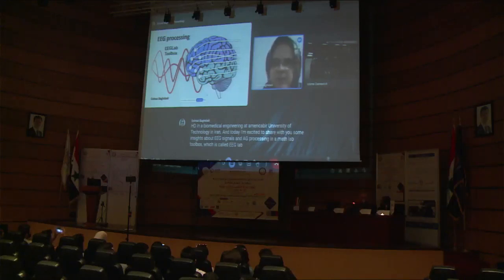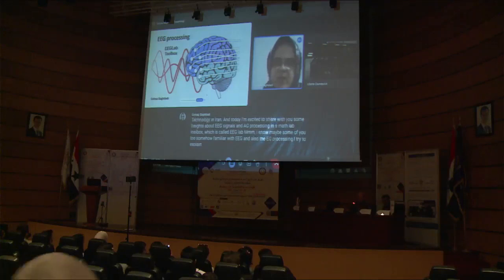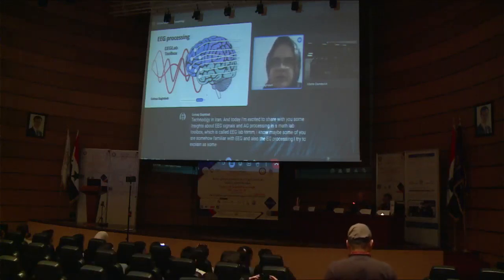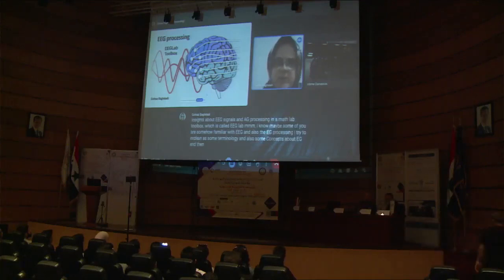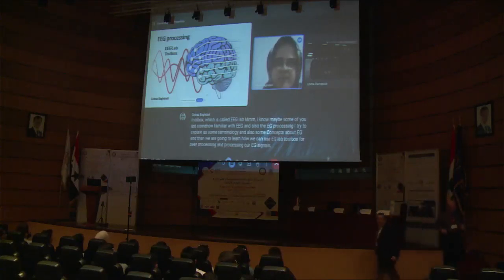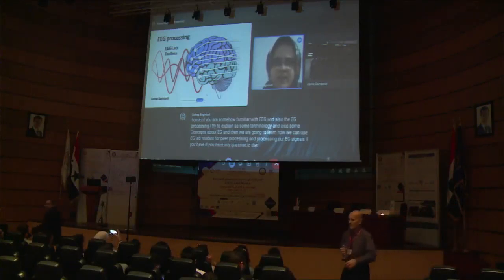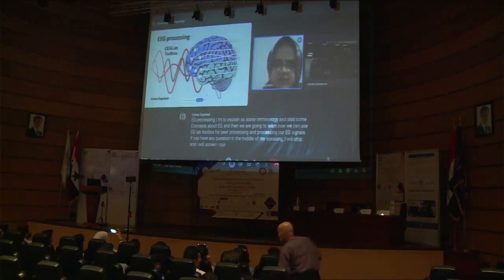I know maybe some of you are somehow familiar with EEG and also EEG processing. I will try to explain some terminology and also some concepts about EEG, and then we are going to learn how we can use the EEGLAB toolbox for pre-processing and processing our EEG signals. If you have any question in the middle of my speaking, I will stop and answer your questions.